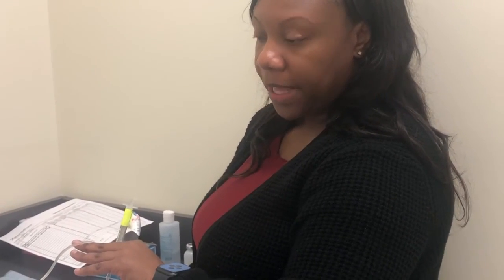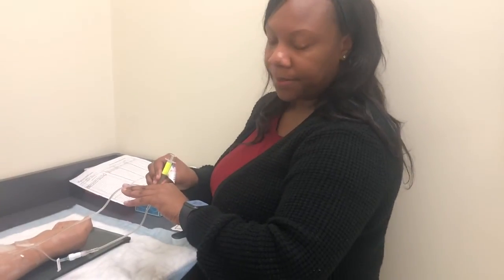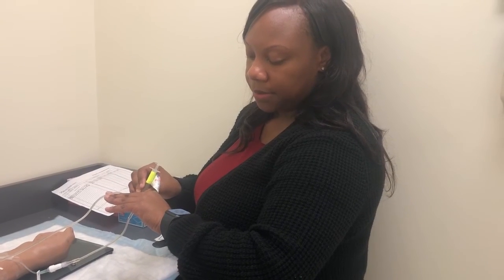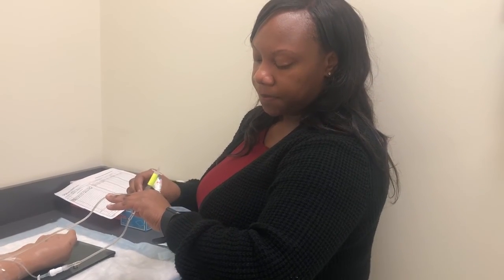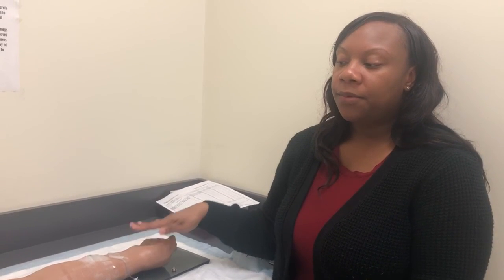Constantly monitoring my patient at this time, making sure no discomfort is going on with her, and there is no discomfort. So she did tolerate furosemide 30 milligrams well. Alright, that's 30 seconds. Everything she has tolerated well. I will do some reteaching, making sure if she feels any dizziness while getting up, to use her call bell. So her call bell will be in reach. Bed lowest position, side rails up. And this ends my competency.